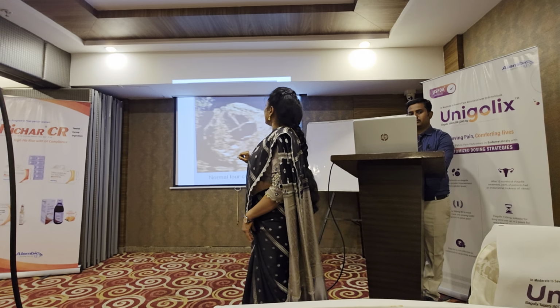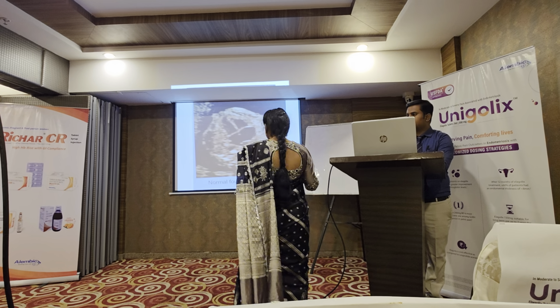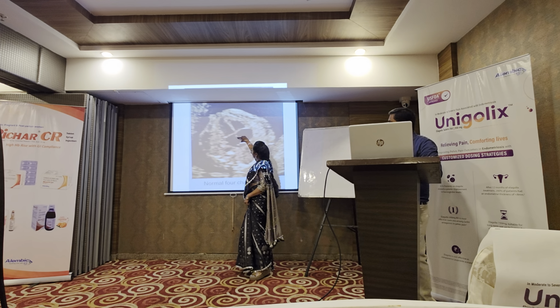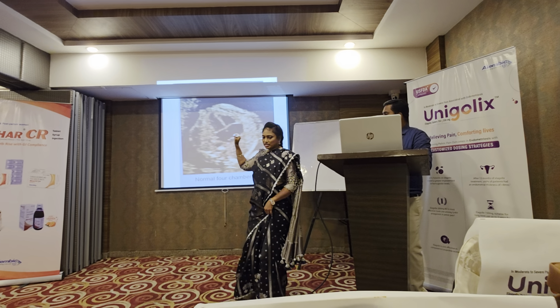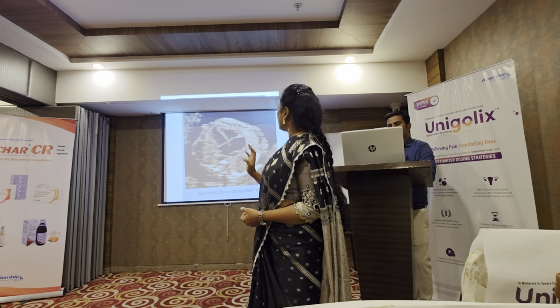And in the right ventricle, you should be able to see the moderator band. And this septum primum should be there to rule out ASD. This is the septum primum. So if that is not there, there is a huge large ASD. If that is there, everything is fine. Even otherwise, if there is a small ASD, it closes on its own after birth. You don't have to worry.